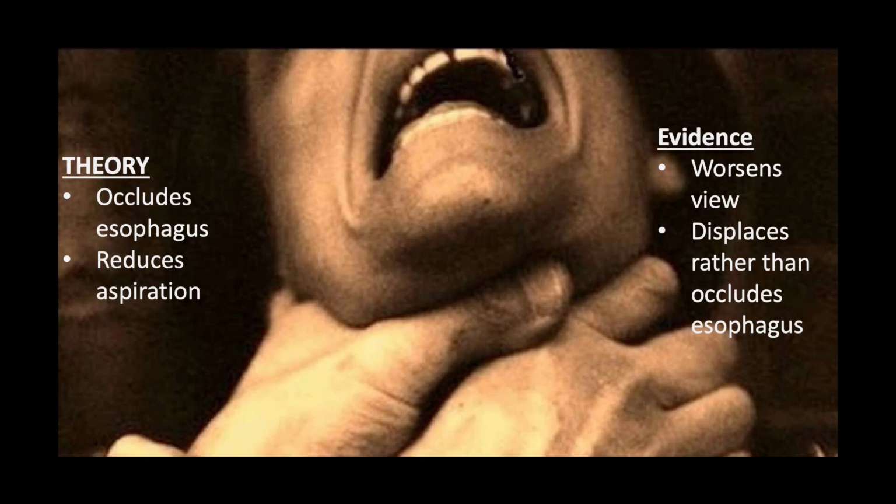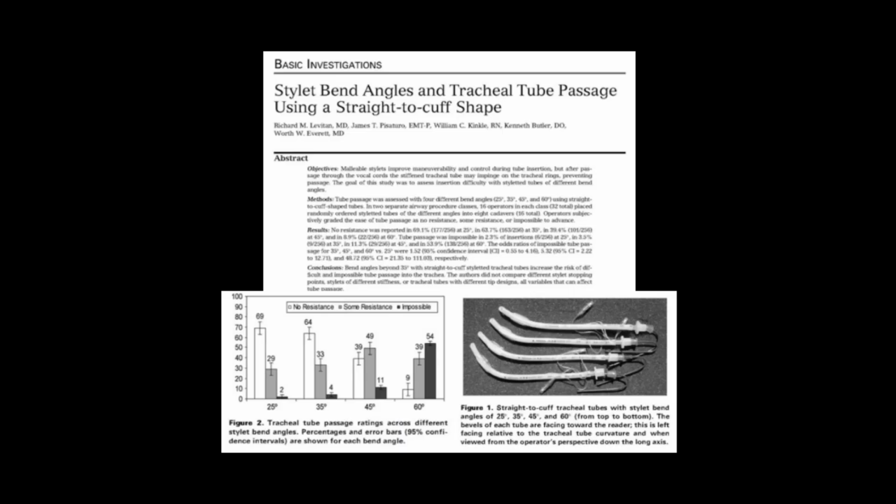Even in patients who are not fasted, Jake and I suggest abandoning cricoid pressure completely. Oftentimes, it's not well taught. Airway assistants can be putting cricoid pressure on the wrong structures and rather pushing down on the thyroid cartilage instead. Because the evidence suggests that it does increase your time to intubation and decreases your view and does not prevent aspiration, Jake and I would advocate that you abandon the Sellick maneuver in your standard RSI.